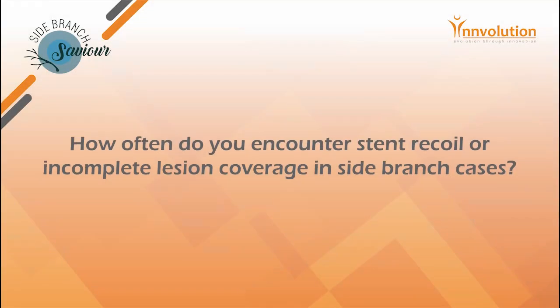Now, in terms of side branch axis, the problem can happen with the angulations of the side vessels, and access to it depends on how many struts are across, getting hardware across. Many times we have an issue with stent expansion at the side branch because of ostial lesions being tight, in which case we may have to use a cutting balloon or any other accessories that may be required, and finally end with a kissing balloon dilation.